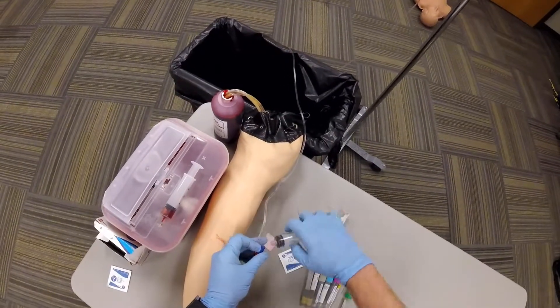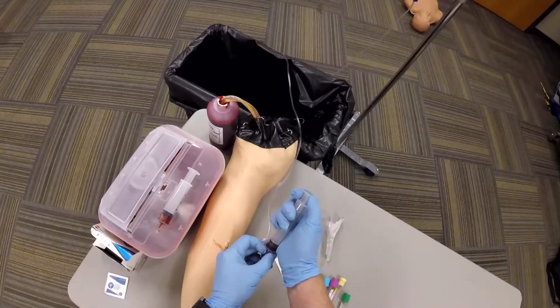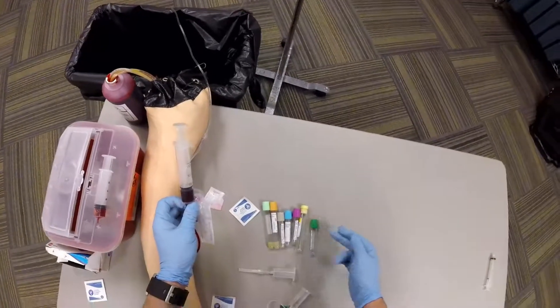Then, again, clean in an aseptic technique, attach, draw back slowly so you don't break up the red blood cells, attach a needle and fill up the test tubes yourself.